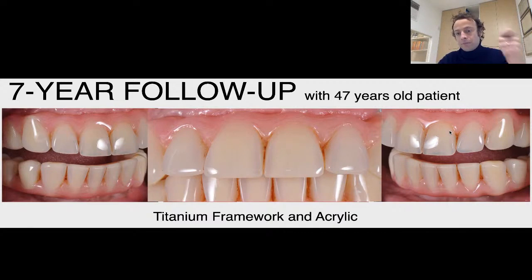is higher. And honestly, this rehabilitation is one of the best rehabilitations that I have in terms of composite reconstruction or acrylic reconstruction. And of course, many clinicians consider that the idea to change the teeth with a new one after 5-7 years is something that is normal. It's something that is part of the therapy.